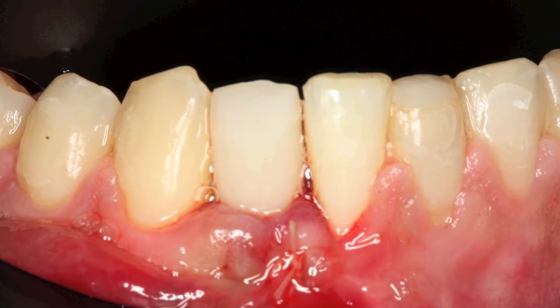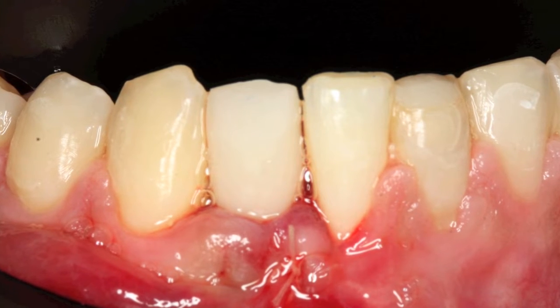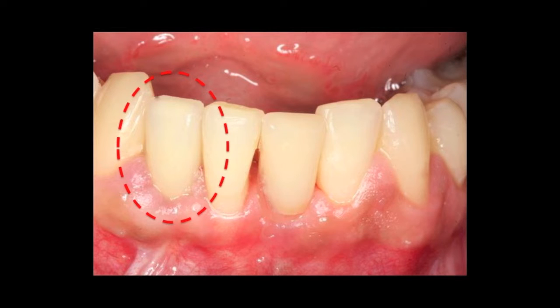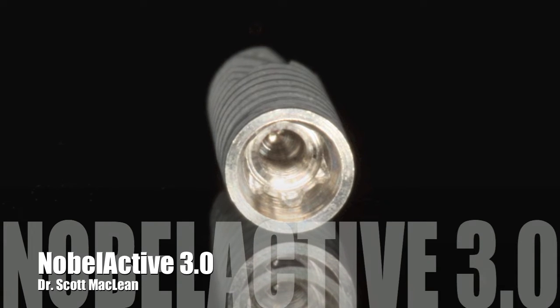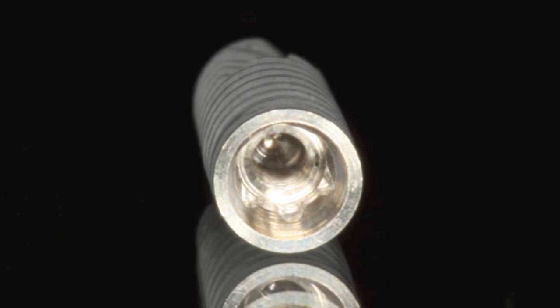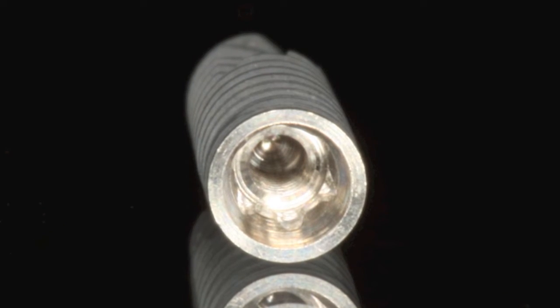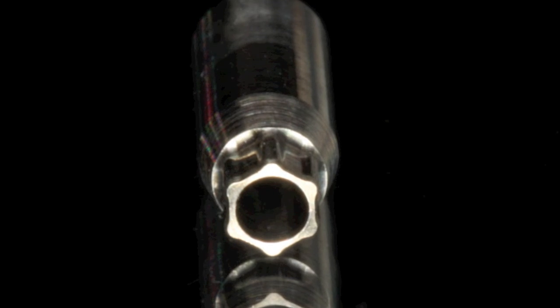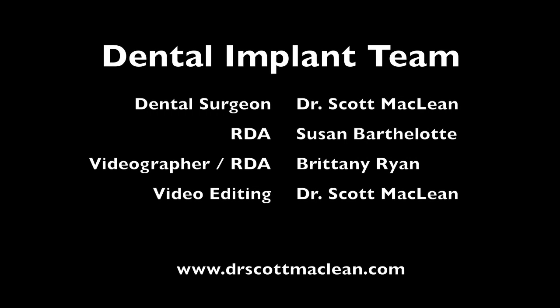Here is the result — this is amazing. You can see in this particular case the papilla have grown in very, very nicely. The implant looks great and the patient is going to be thrilled with this. In summary, this implant is a great implant due to the size, the platform shift, the conical seal, and all the features of the hex lobe which make this easy for prosthetics. This is Dr. Scott McLean and this is a YouTube presentation about the Noble Active 3.0.